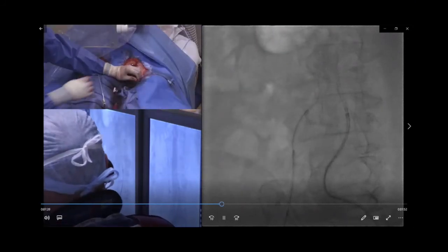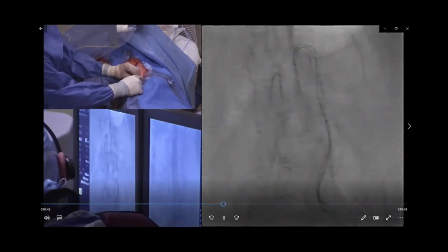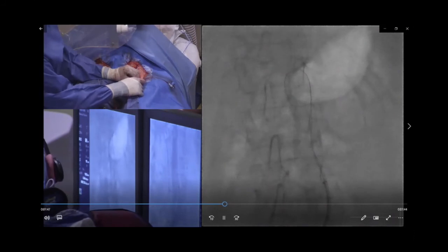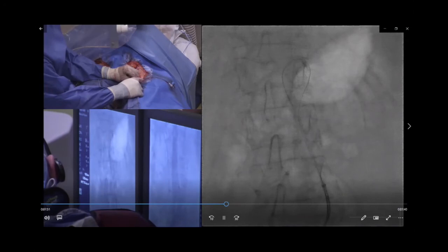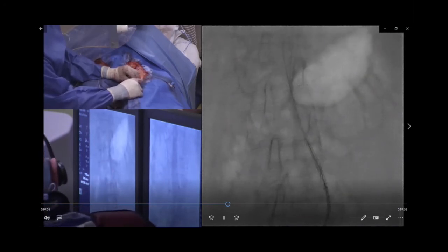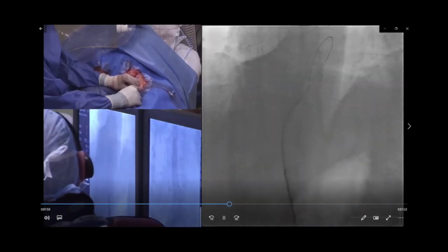Can I ask a question? Yeah. I'm not familiar with this diathermy technique. Obviously the congenital guys like Shak and I are very familiar with the radiofrequency kit that we use, which presumably isn't powerful enough for this. Can you just explain to us exactly what you're using? Because it looks a little bit handmade, really.